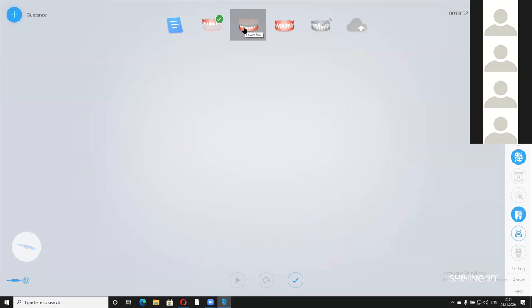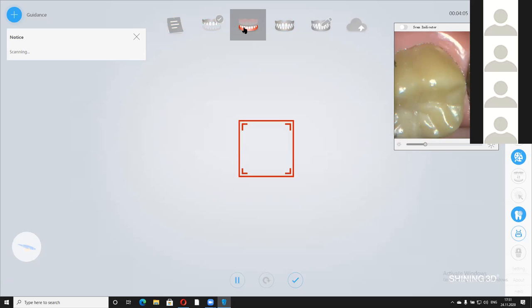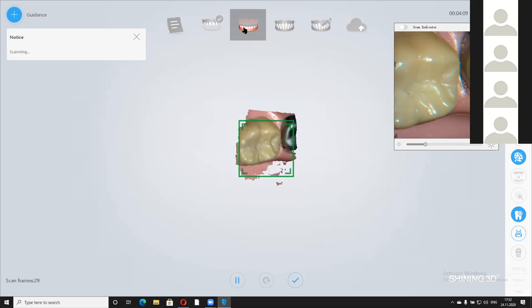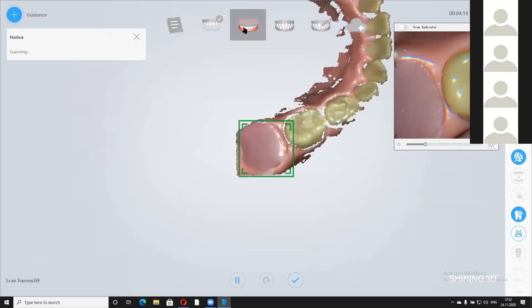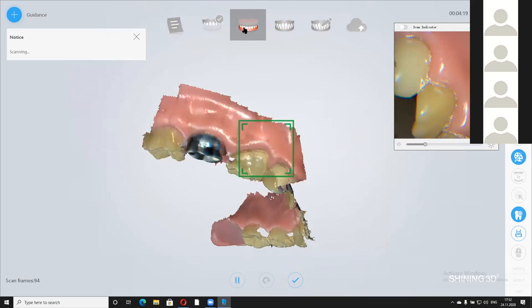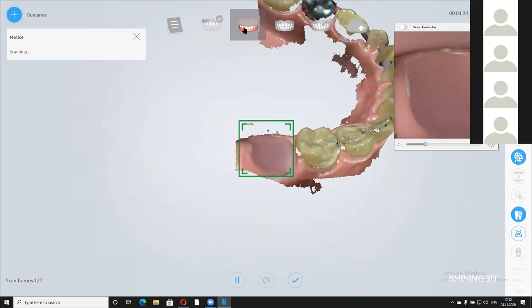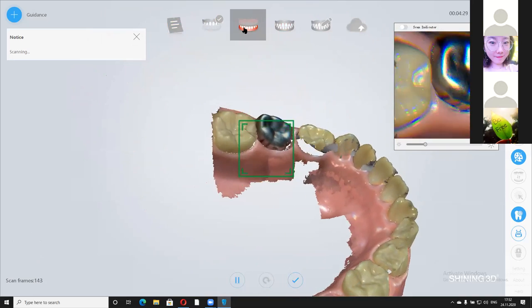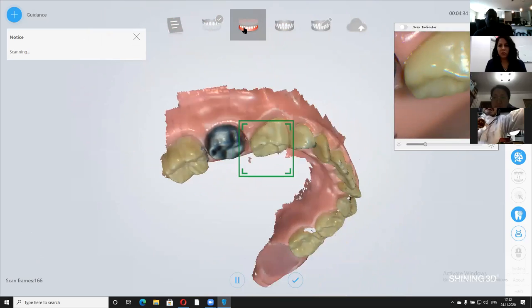And it jumps automatically to the lower jaw. So I again take the lower jaw here, take the camera, and do the same thing. I start on the molar. Other systems, they say go like this, they say go forwards like this. I can do this also, very fast. Okay. If you want to do it fast, you can do it, but the scan strategy here, what they are recommending is basically to scan like this. Left and right, left and right, left and right, like this, okay?